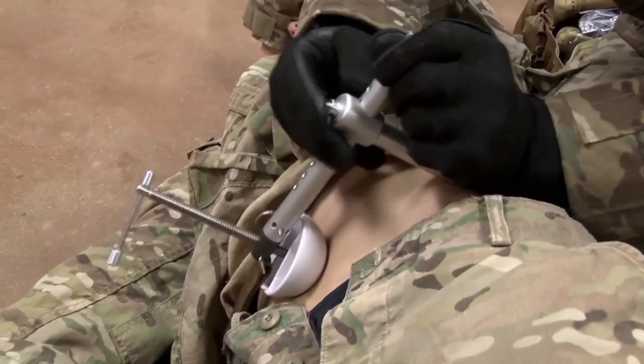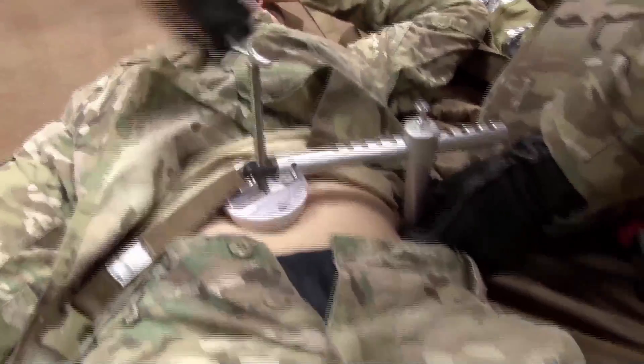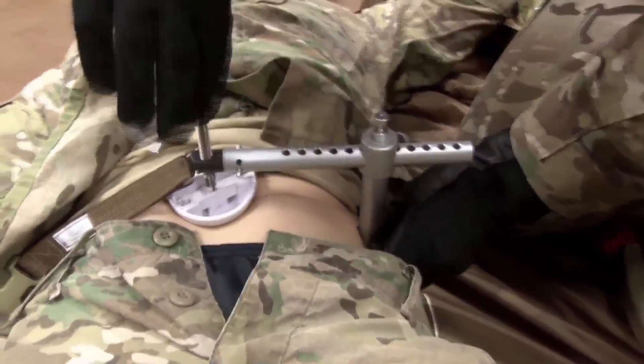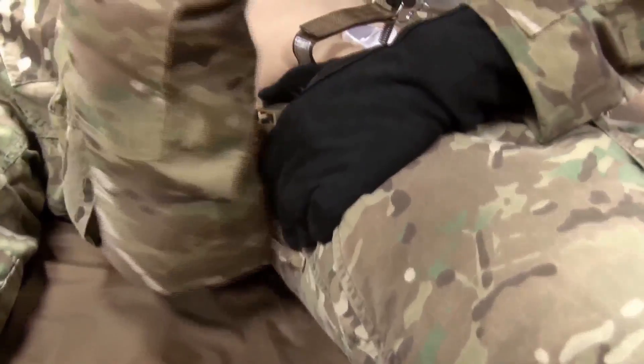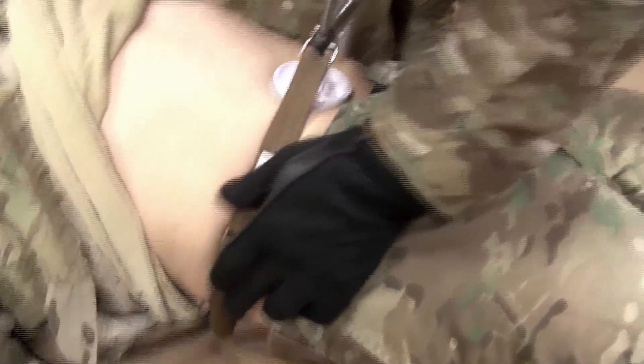Adjust the horizontal arm to position the pressure disc over the pressure point. Apply pressure by turning the T-handle clockwise. Apply pressure until the bleeding stops. If hemostasis is not achieved within 20 full turns of the device, consider releasing and repositioning the pressure disc. Attach the securing strap and cinch it to the body, then write the time of application on the label.